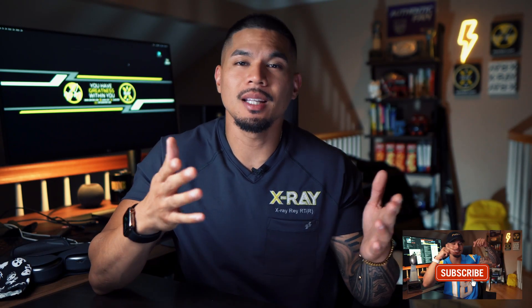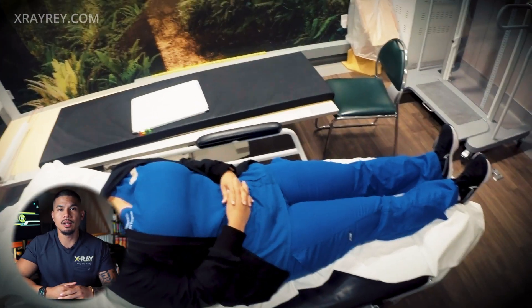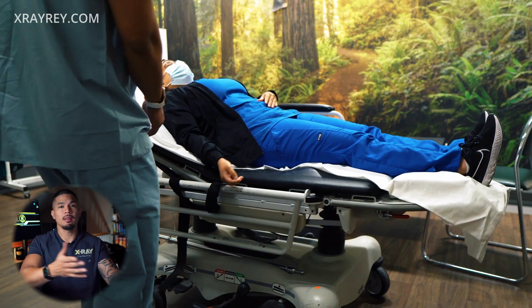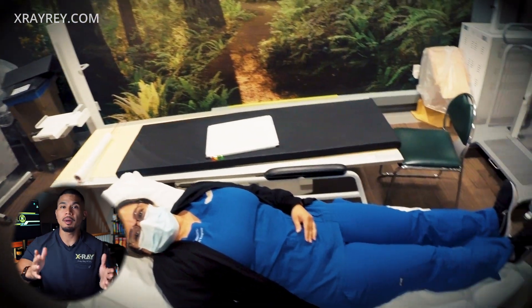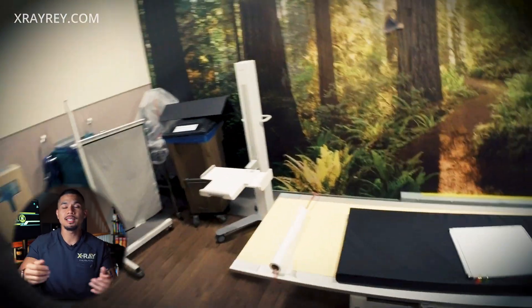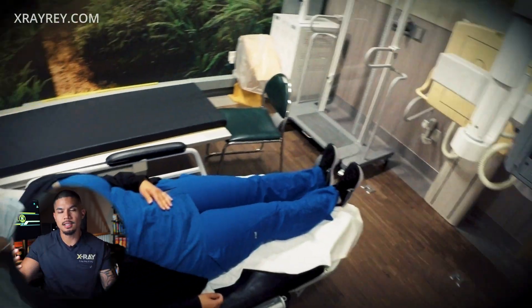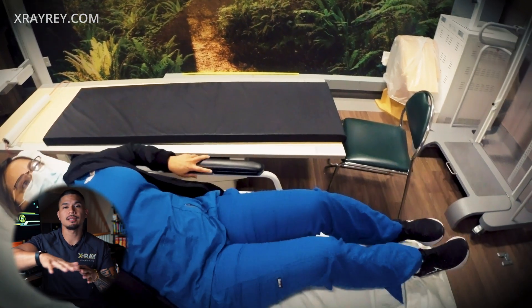So to x-ray the wrist — it may sound easy and it is — but if you have little experience you're going to run into some obstacles. Let me clear them for you. There are several ways to x-ray your patient's wrist in a gurney; this is just one. Ideally if my patient were able to, I'd have them swing their legs over, use a mayo stand as a table, and x-ray it that way. However, my patient's wrist is immobilized and they may be a bit medicated, so I'll just take the situation into my hands and work around my patient. First, I'll lower my patient's head to get a flat surface.